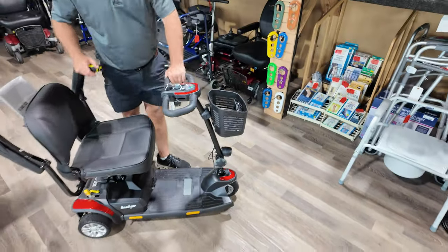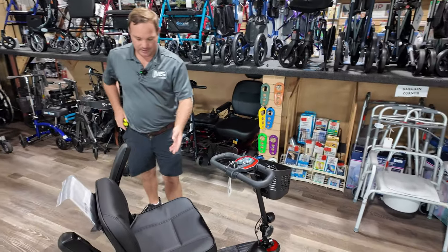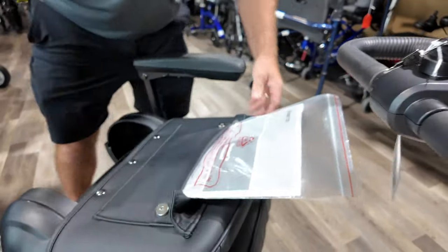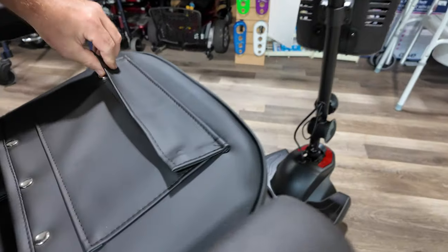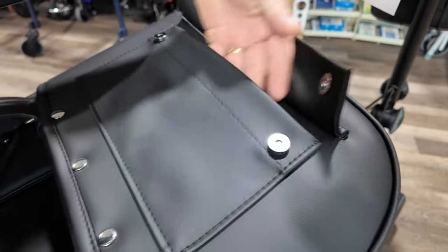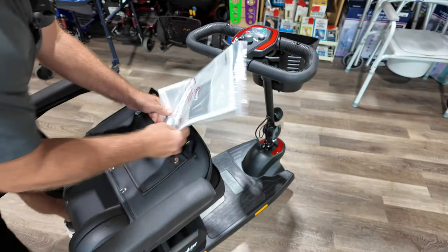One thing I like about this unit is the rubber — it seems like it's going to last. The seat is very comfortable; I like the new seat. You're seeing the same seat on other units like Golden's, and it's very lightweight. There's also a little chart pocket back here — it's not very big, but it has a cool magnetic button closure. Right now we have the manual in it.